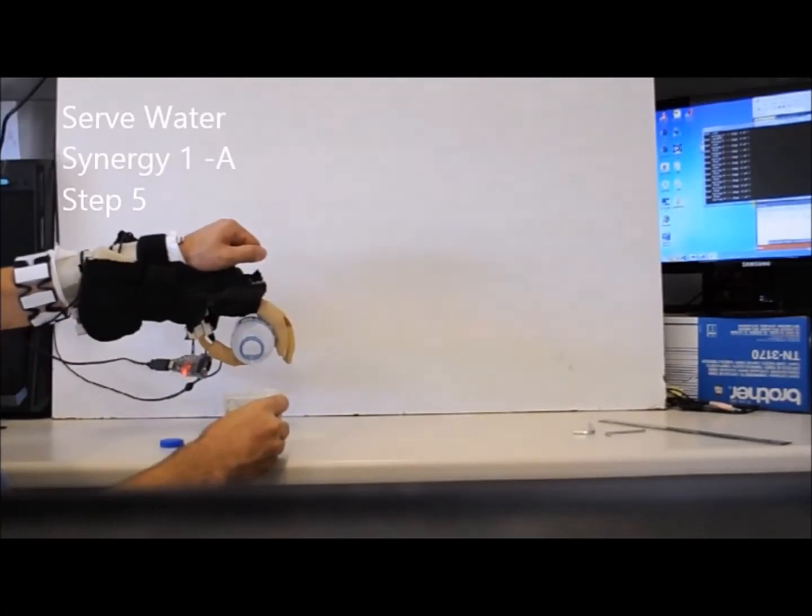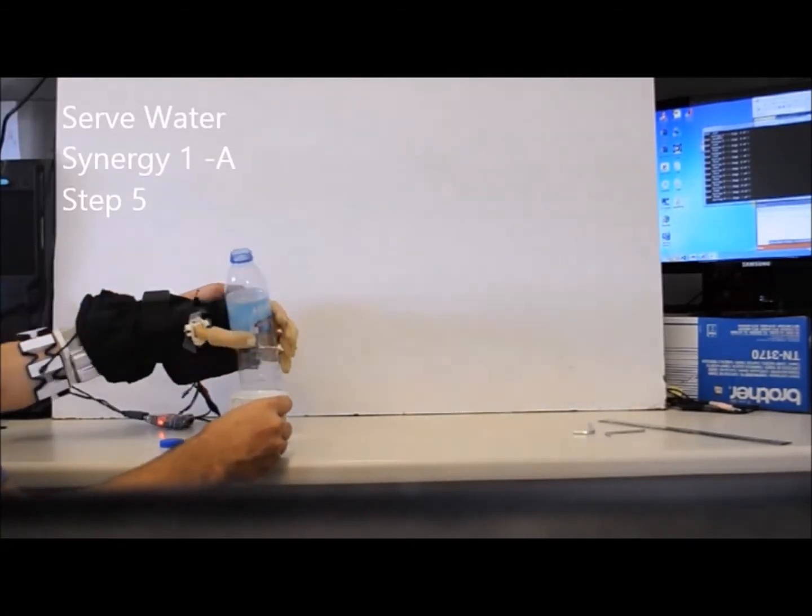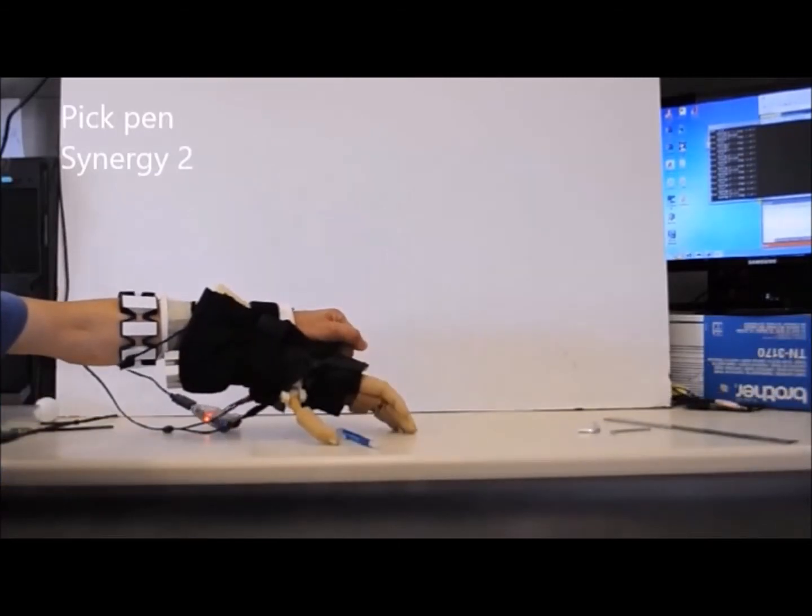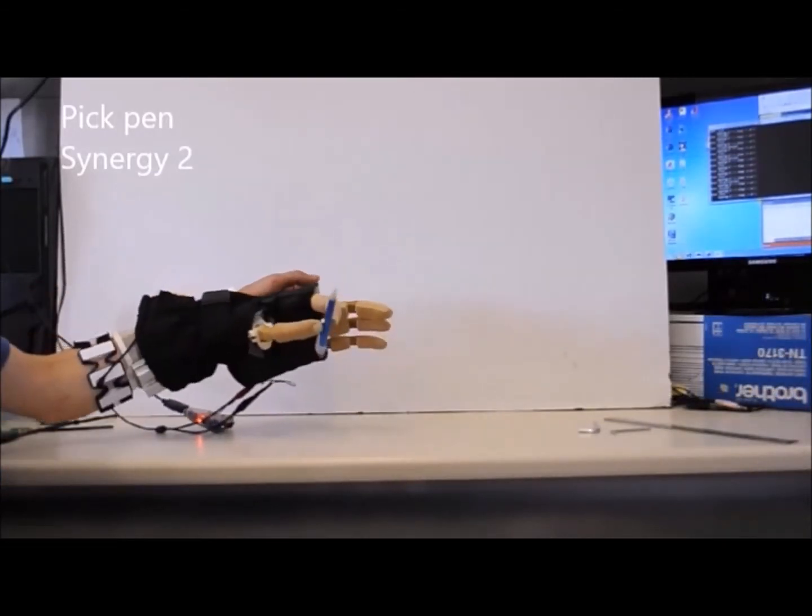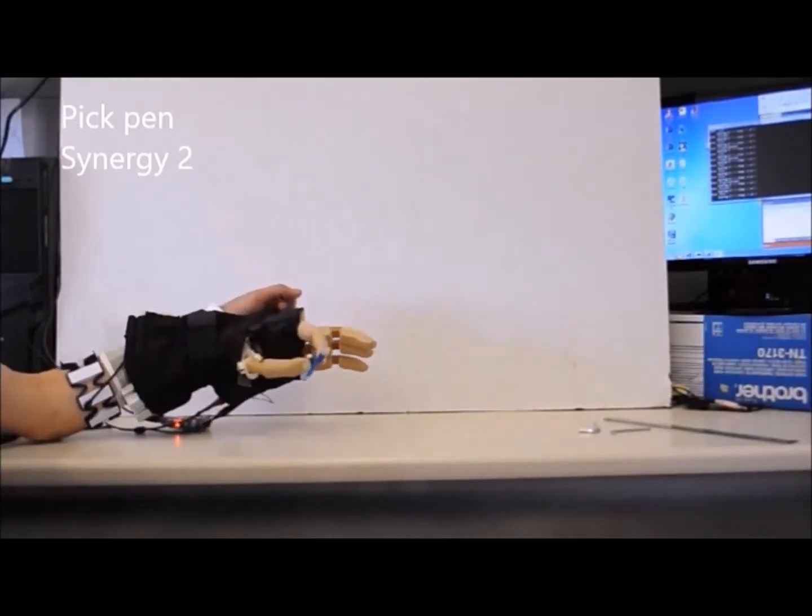Here, we show how different objects are being grasped with the ISR Softhand with different synergies. The users can pick an object on a table or easily serve water.